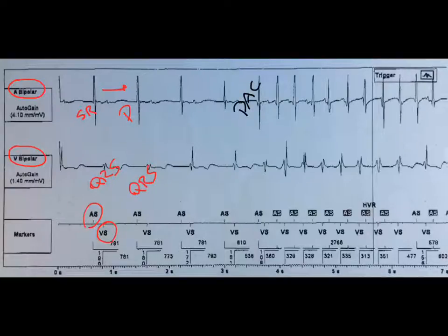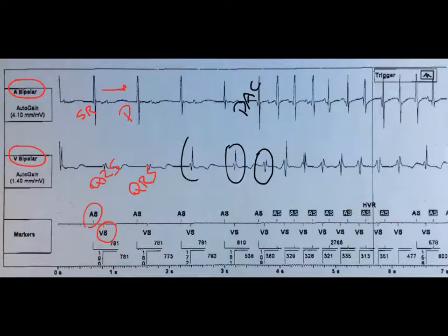How about this QRS, or this one over here? That one's different also — it's a little different. But it comes sooner, and the R is not high above the baseline. It has a different morphology, but also this one has a different morphology, and this one as well, and this one as well. So the morphology on this case for the QRS is not very useful.